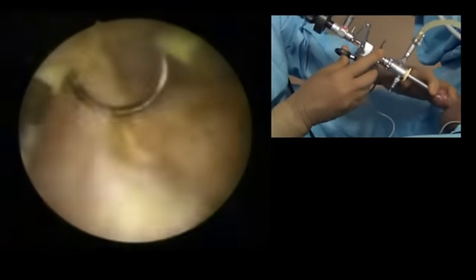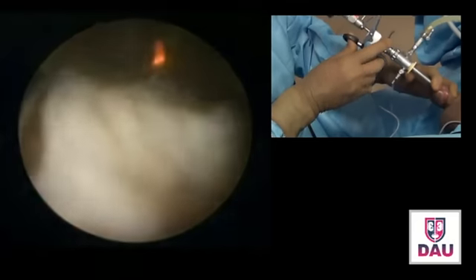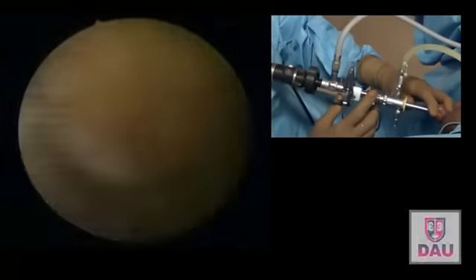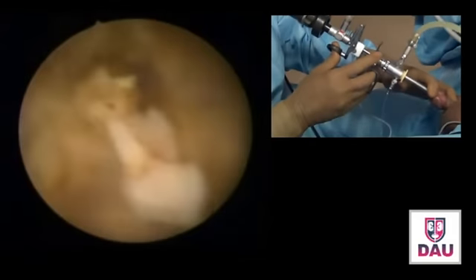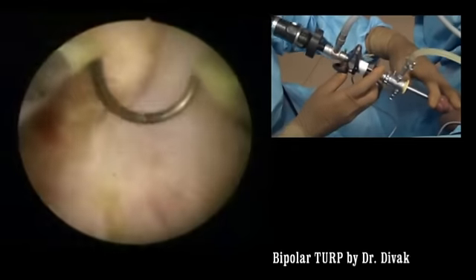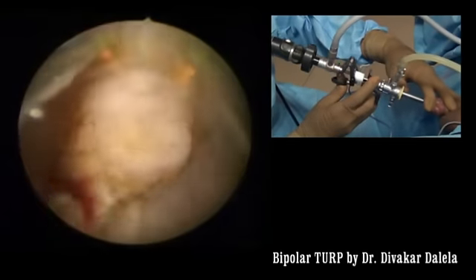The saline irrigation. I just make a deeper cut at the level of the apex, close to the apex. Smoothen this area, and I now know the depth of the cut. Okay, cut this one.